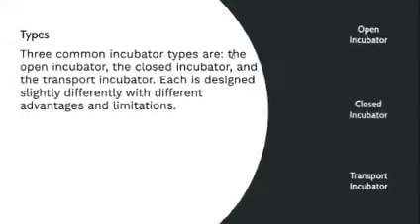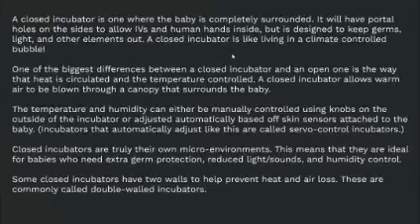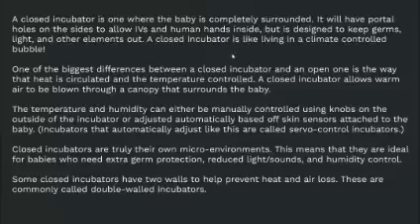Now we will move to the closed incubator. A closed incubator is safer and is one where the baby is completely surrounded, forming a biological bubble. It will have portal holes on the sides, which will facilitate the attendants to turn the baby, and the holes are large enough for human hands to pass through them. It is designed to keep germs, light, and other elements out, forming a climate controlled bubble.